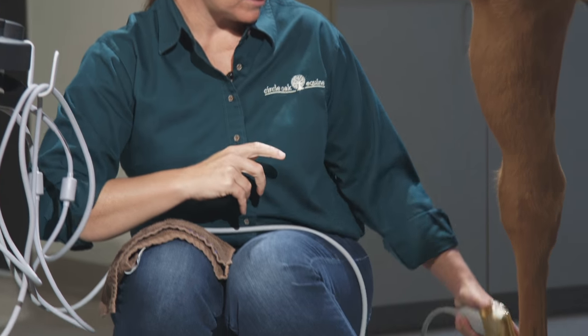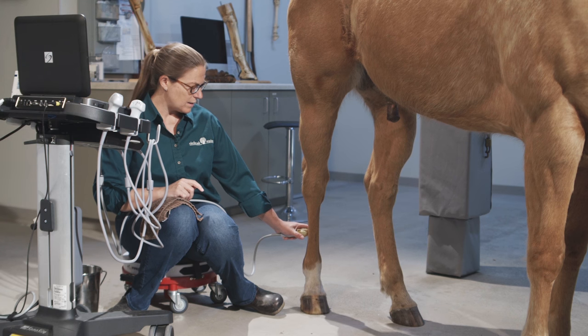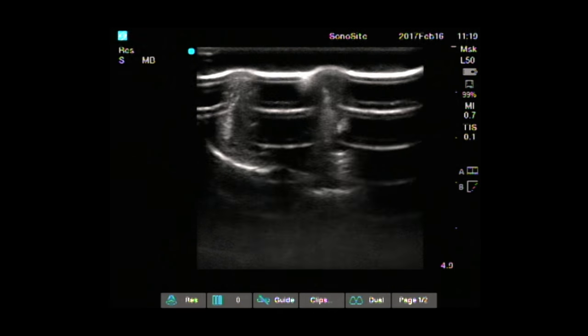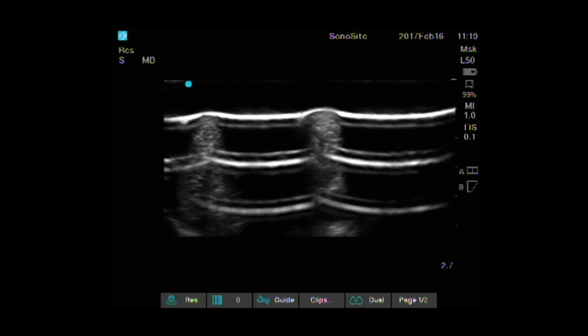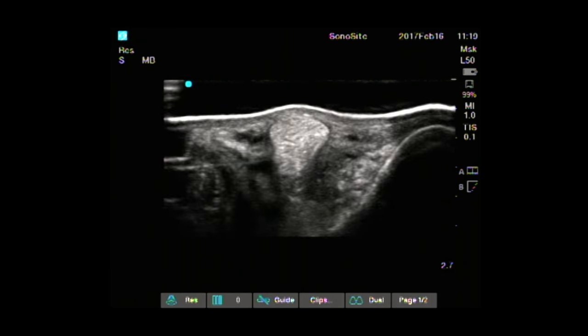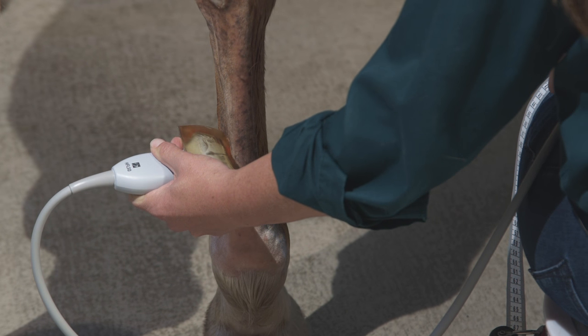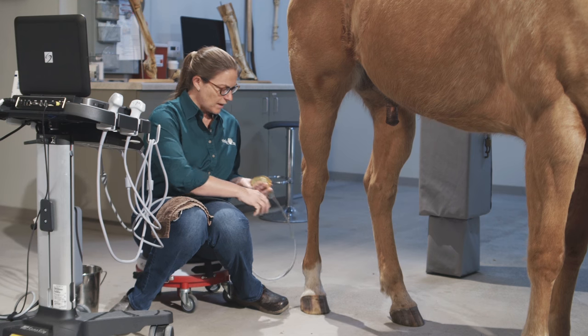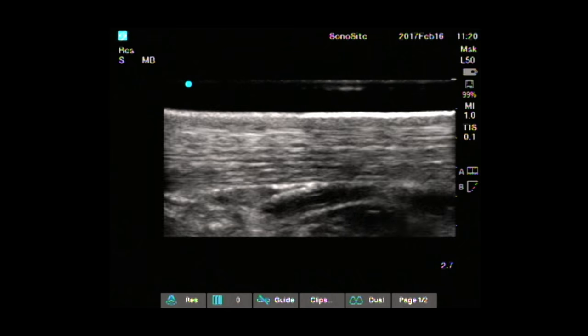At the split, I swing medially or laterally and scan down the branches. If I don't have a standoff on, I'll go ahead and put one on to help scan the branches of the suspensory, unless the leg is very swollen. Starting around the 18 to 22 centimeter mark, I scan the branches — decreasing my depth since we're looking more superficially, and adjusting gain to maintain good image quality. I scan down each suspensory branch in short axis all the way to the insertion onto the sesamoid bone, then do the same on the opposite side. Once done in short axis, I go back and repeat in long axis, scanning all the way to the insertion onto the sesamoid bone and taking pictures of anything abnormal.